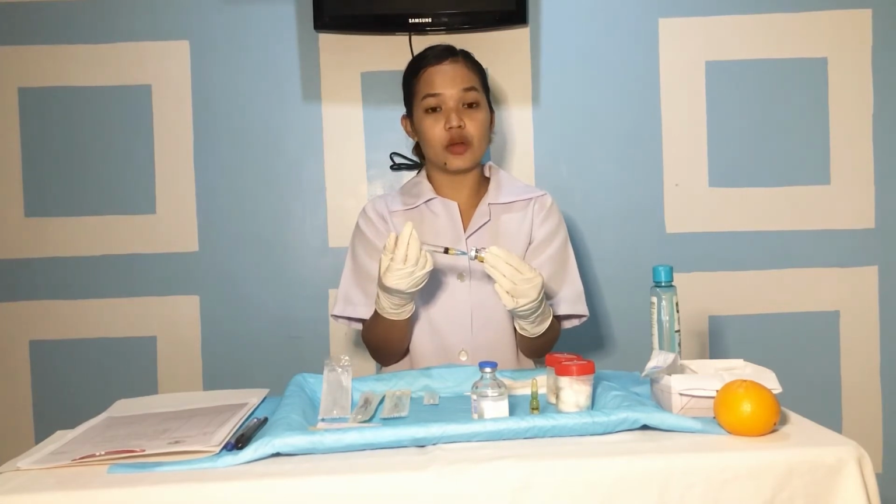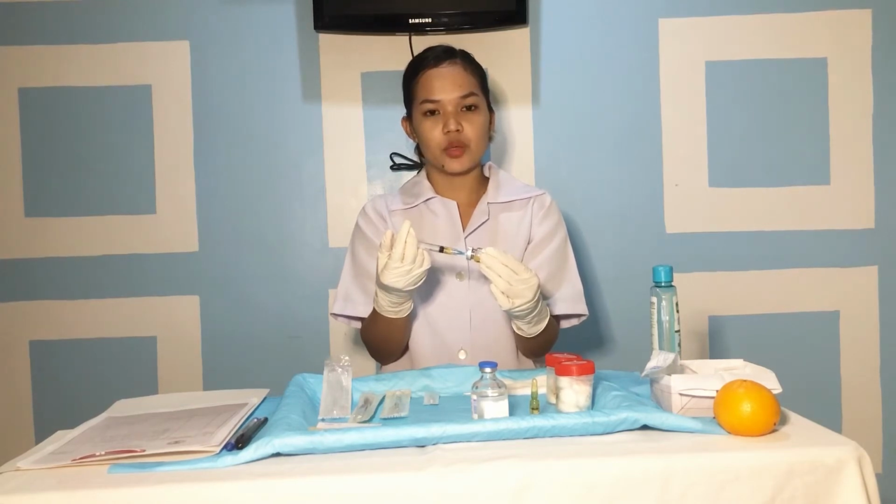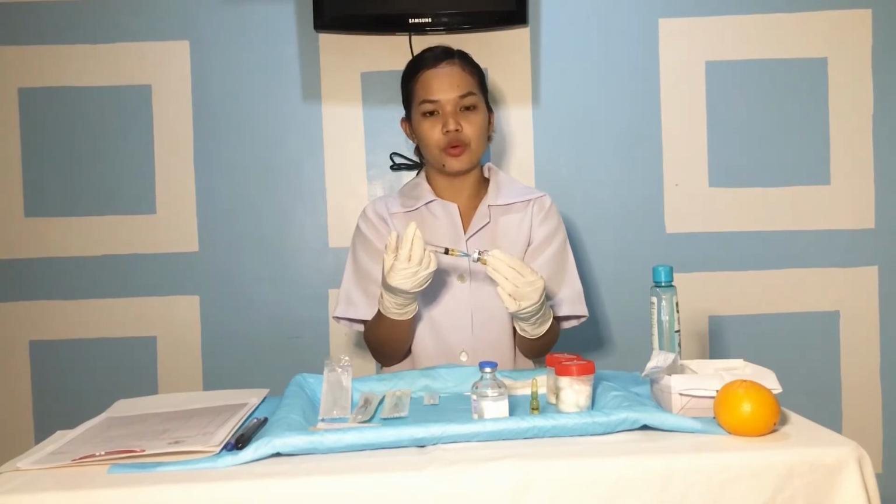Next, allow the air pressure from the vial to fill the syringe gradually with medication. If necessary, pull back slightly on the plunger to obtain the correct amount of solution. Positive pressure within the vial forces fluid into the syringe.